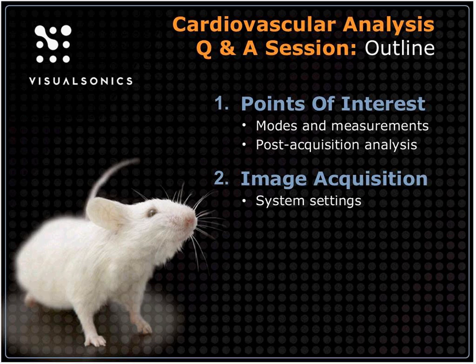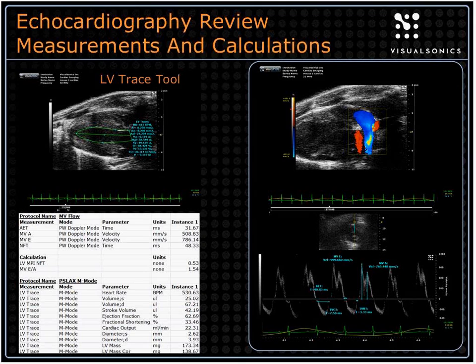As Andrew said, we'll just do a really quick overview, and then we'll move into the actual Vevo software and get a look at some cardiovascular images. Everybody that's on, please go ahead and put questions in as we go. We have a few questions here that were submitted previously on registration. We'll try and maybe answer those first, and then we'll play it by ear and see what comes up.